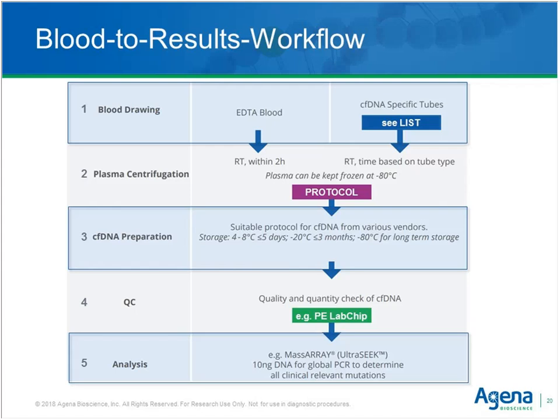Then, if we have blood, there's a time-dependent component, but the next step is the plasma centrifugation to obtain the blood plasma that contains the cell-free DNA, which in the third step needs to be isolated and concentrated.